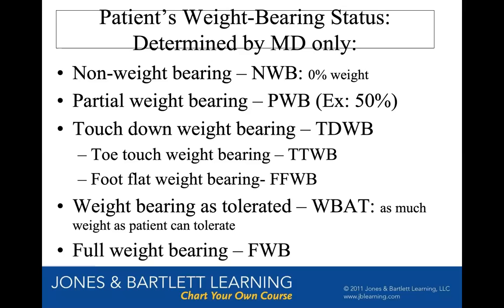So if it's lower extremity and they've been moved to toe touch weight bearing, they're walking with crutches or a walker, we can tell them when you're walking, you can put just your toes on the floor, just enough for balance, but that's all the weight you can put through it. But you can rest your foot on the floor when your foot gets tired, and you can use it during gait for balance, but that's it.